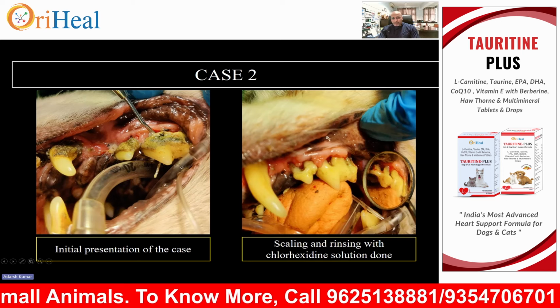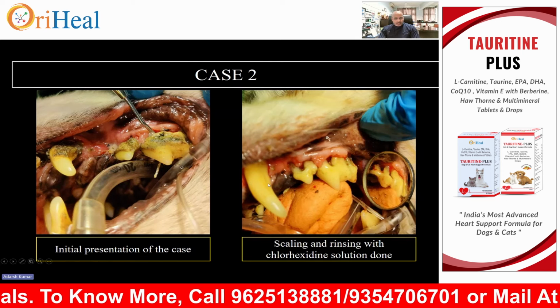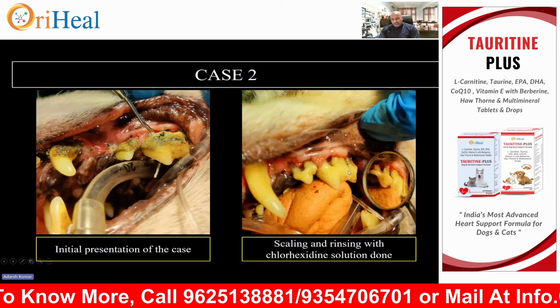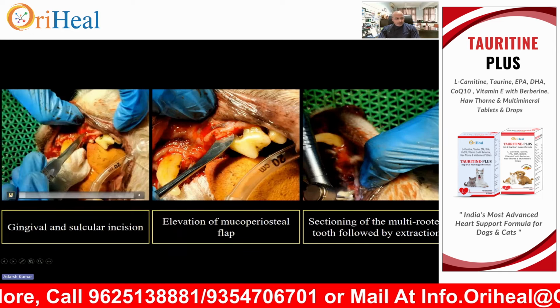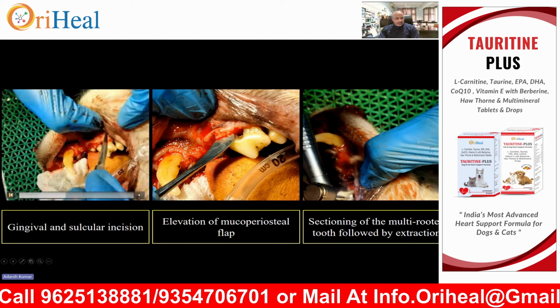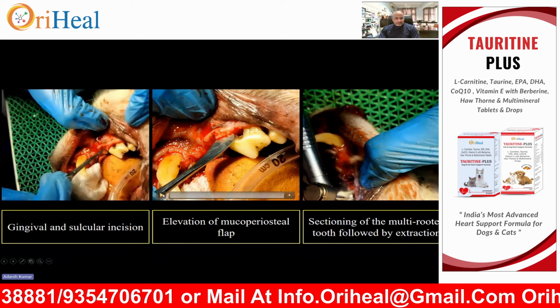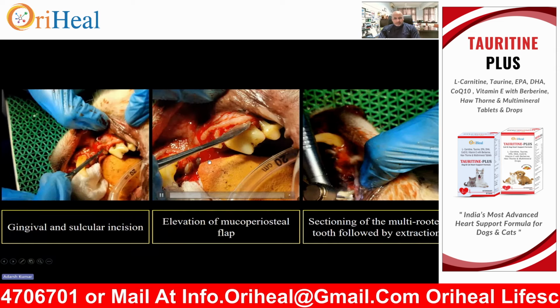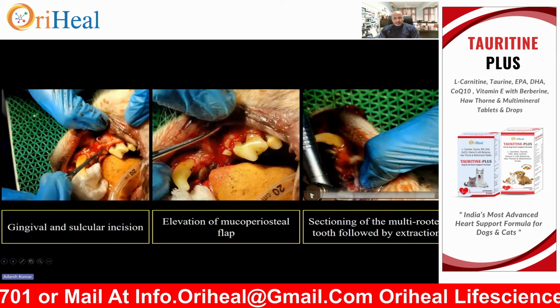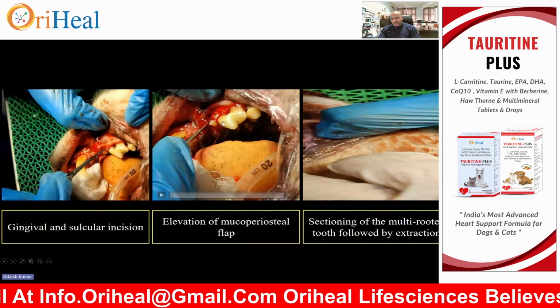So this is again a case. Initial presentation of the case is like this. Then scaling and rinsing with the chlorhexidine solution. Then the gingival and sulcal incision is being given here. Cut it like this. Okay. You raise the mucoperiosteal flap very gently, and then you section the tooth, cut the tooth from here.